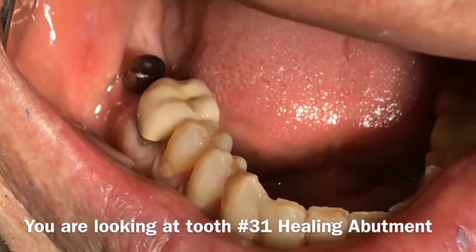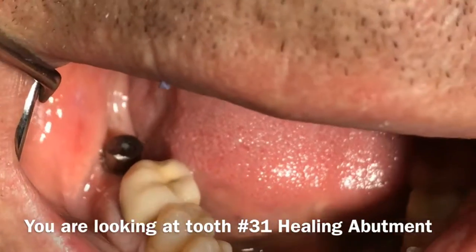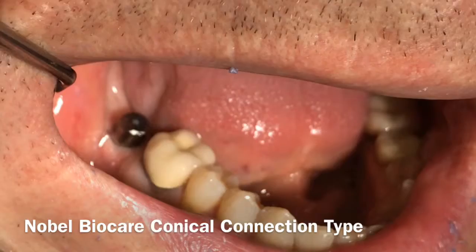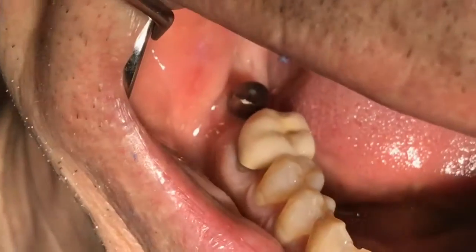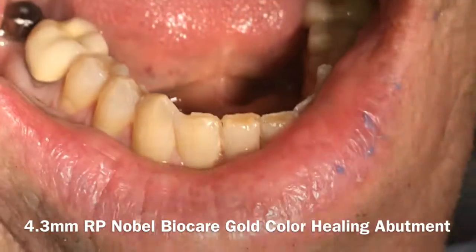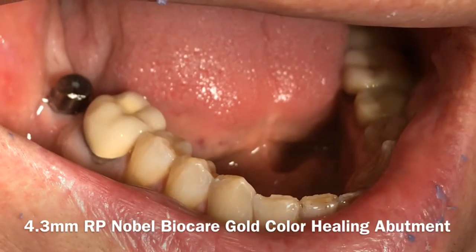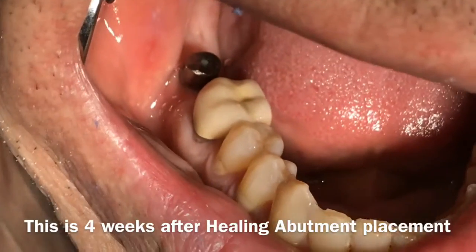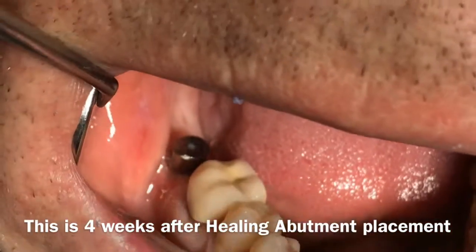You are looking at the healing abutment of the Nobel BioCare Conical Connection Parallel System. You can see that once you put the healing abutment in, you let the patient come back about four to five weeks later.